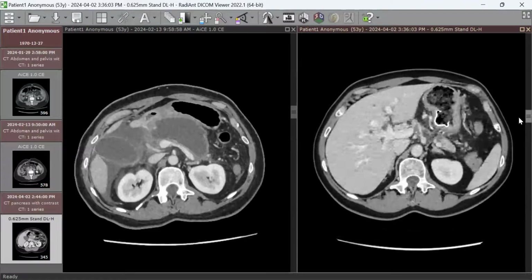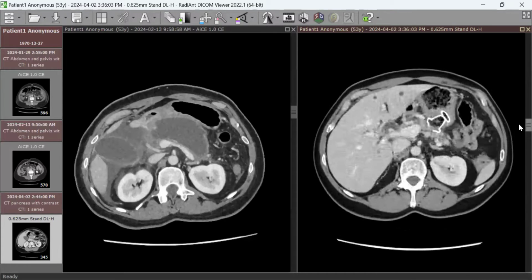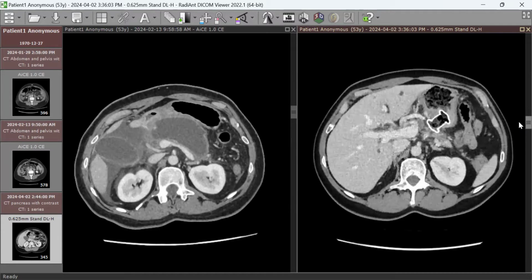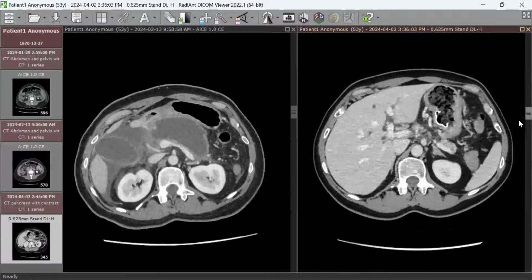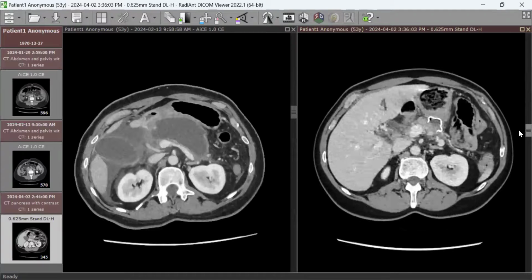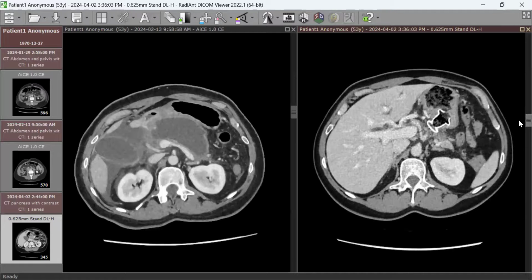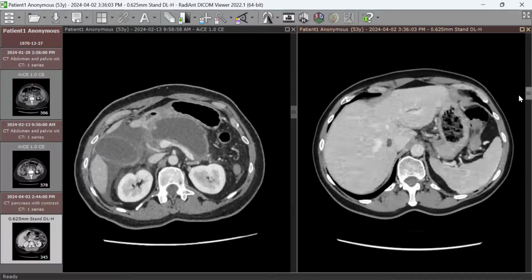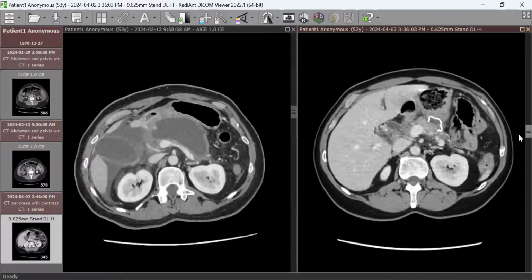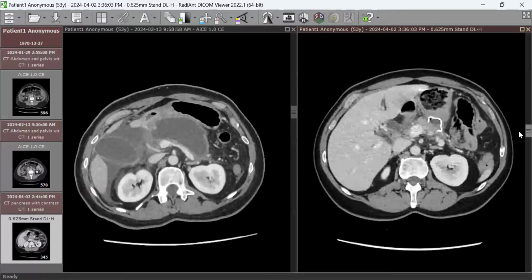This device is called Axios stent. Axios, A-X-I-O-S. It's introduced endoscopically and removed also endoscopically. It can stay up to 60 days, and it is used for transgastric drainage of pancreatic pseudocyst or pancreatic walled off necrosis. It also can be used to drain the gallbladder for patients who cannot tolerate surgery or cholecystostomy, so they can also use that.